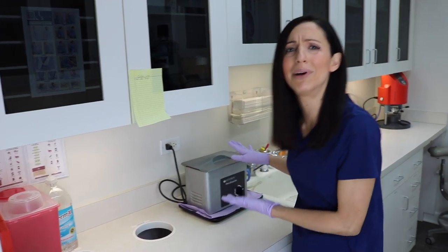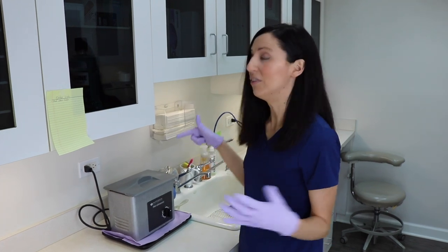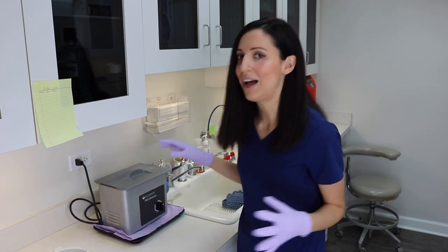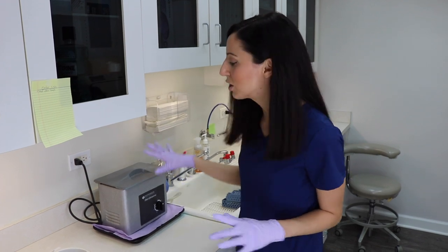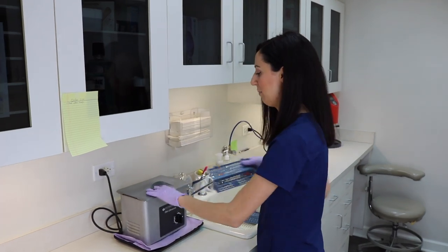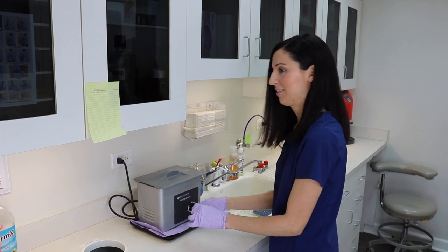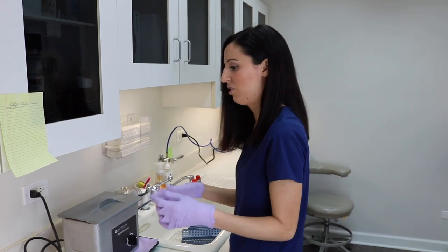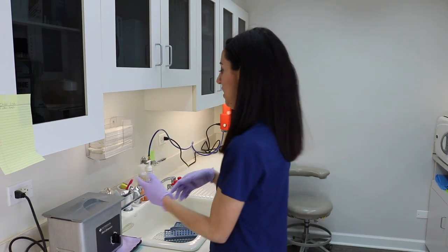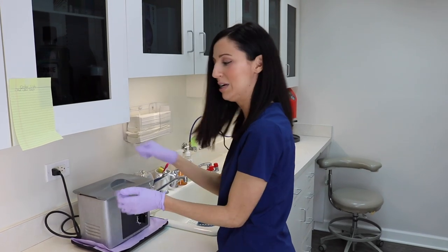We have our ultrasonic — a lot of people ask about it. If you're not a dental person, the ultrasonic does not sterilize at all; it's actually probably the dirtiest part. You put your instruments in the basket, fill it with water, close it, and it agitates to get particles off. It's like a nicer, covered way to get the crud off rather than scrubbing with a toothbrush.